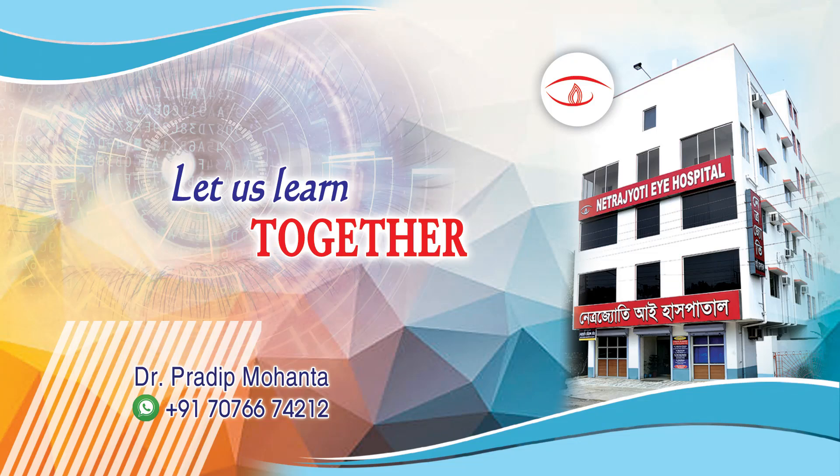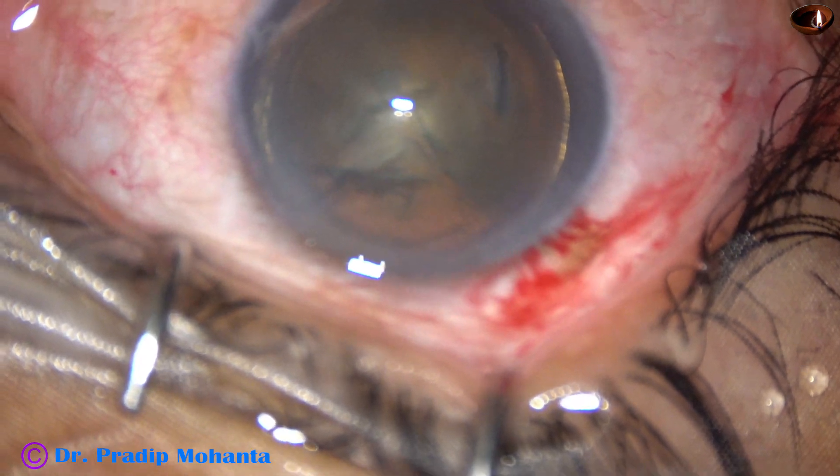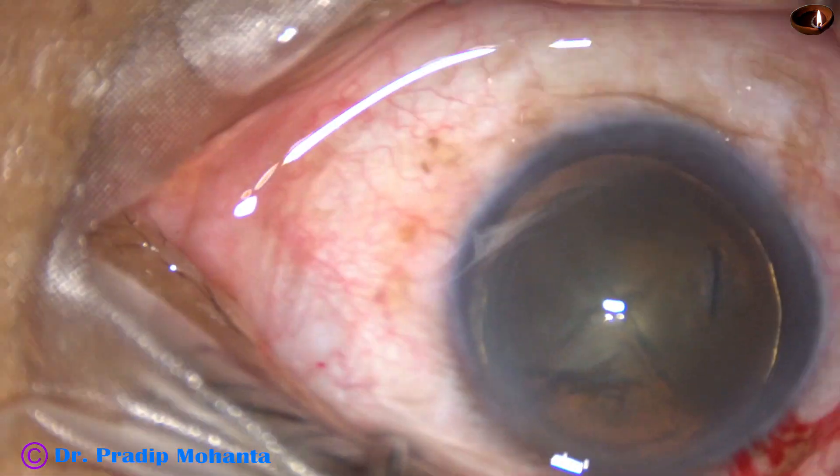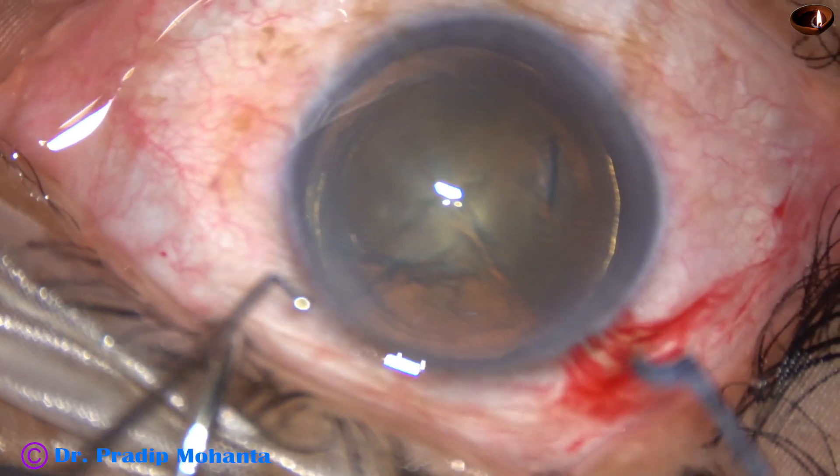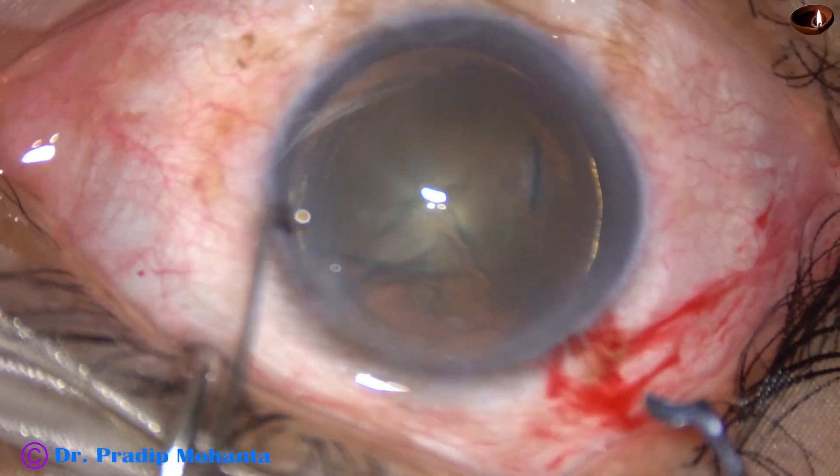Friends, in this video we are going to see nucleus management of four soft cataracts with the help of a pre-chopper designed by Dr. Suhail Irfan Khan from Nanded, Maharashtra.